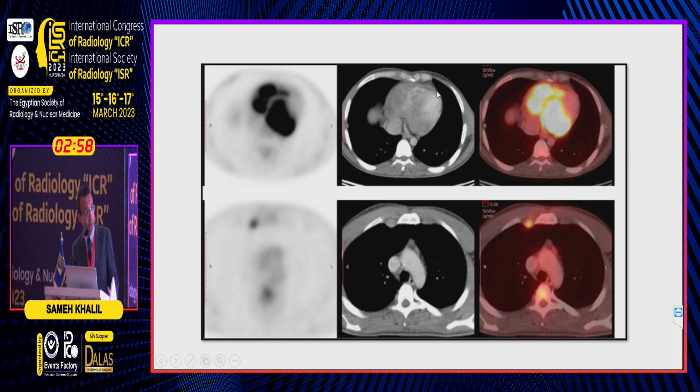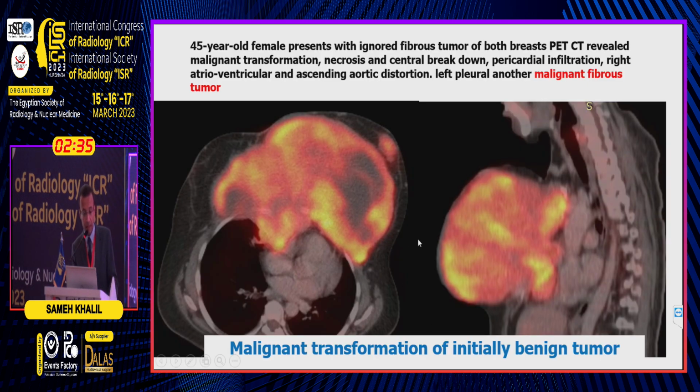PET response. In the PET images, we have activity in the cardiac mass, and also we have internal mammary lymph node and vertebral metastasis to be biopsied for this patient, and to save his life from an invasive maneuver like cardiac biopsy. We can monitor the malignant transformation also.